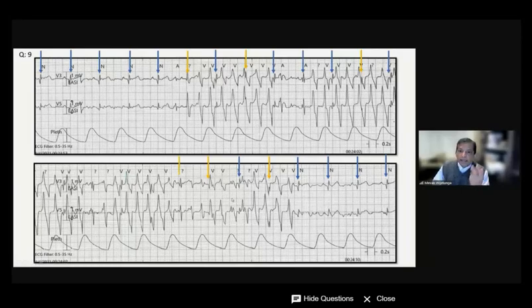And clearly, maybe here, but there is something, I think. Not sure, but there is something. So you can see that marches too. So that's another clue. This kind of marching through, and there's a preceding pattern. So this is artifact. Good job, most of you got it.